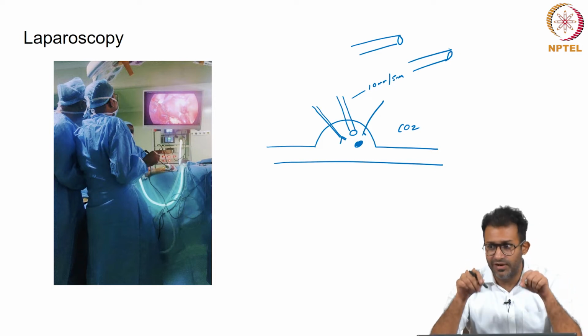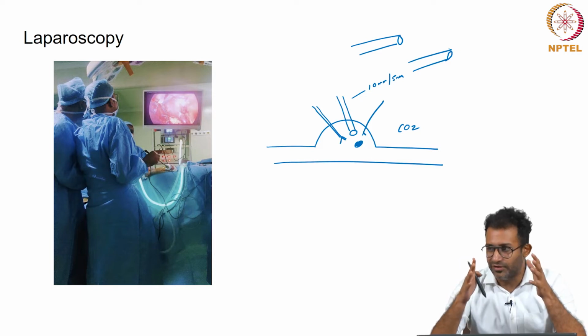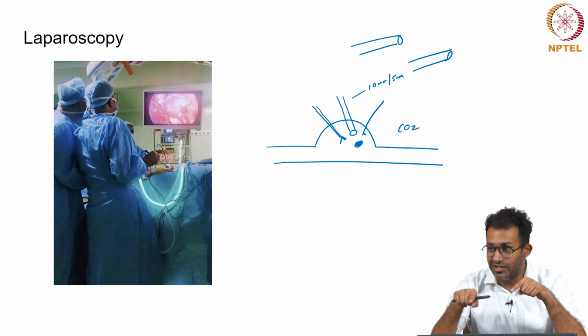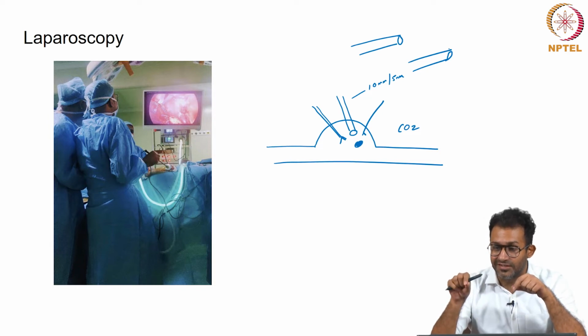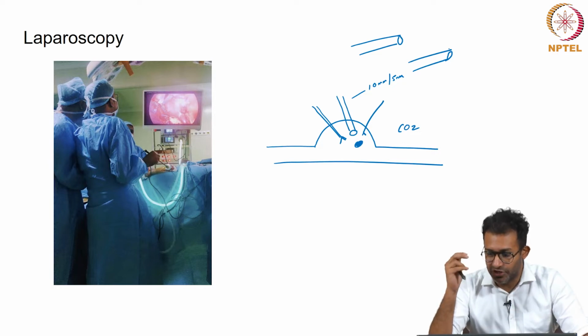There are energy devices which you can push through your laparoscope. There can be electrocautery, and it's a whole different field of physics, surgical electrocautery and surgical energy devices. And these days we are using laparoscopic ultrasound as well, putting an ultrasound device through your laparoscope and trying to visualize certain cancers which cannot be visualized through CT or MRI or traditional ultrasound.